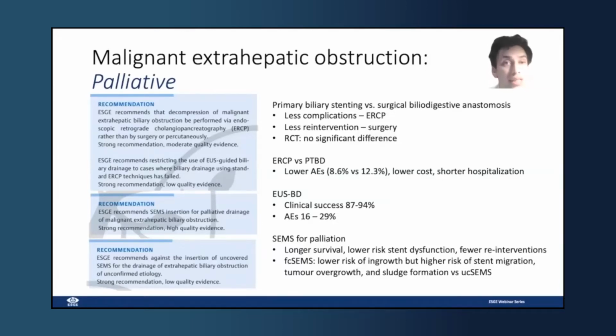Now, when comparing ERCP versus percutaneous approaches, there are lower adverse event rates with ERCP, and it's also been shown to have a lower cost and shorter hospitalization, and this is on the basis of 2 RCTs and 1 national database. ESGE does recommend SEMS insertion for palliative drainage over and above plastic stenting, and that has been shown to be associated with longer survival, lower risk of stent dysfunction, and the reduced need for re-intervention.